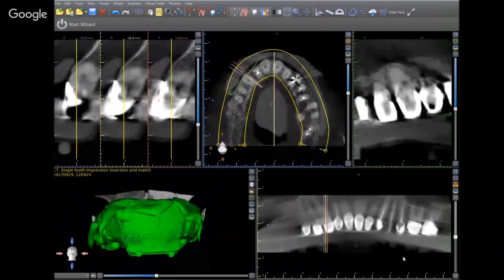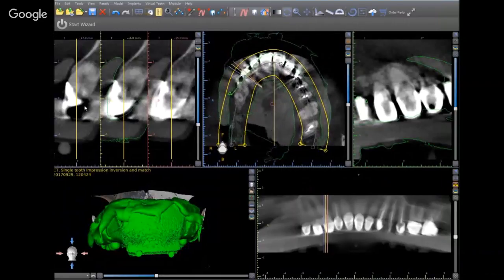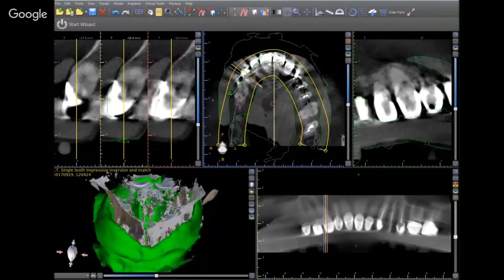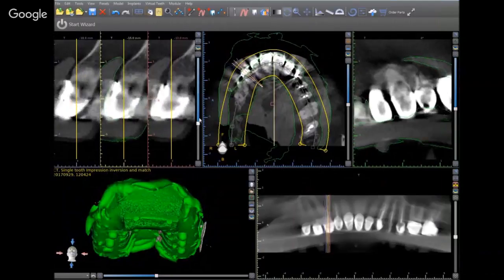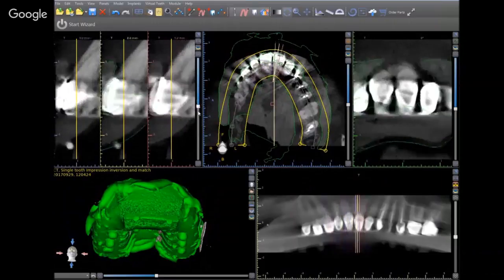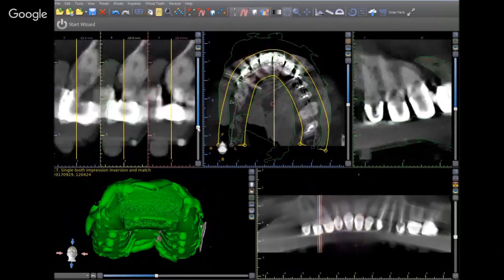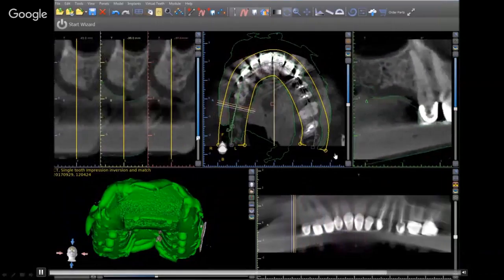That brings it back into your main windows here, and you can see now if you turn on the hint, you can actually see how the 2 images are aligned. What you're looking for here is the lines in the hint to line up with your impression, because the impression will show up in this image. And you can see if you look down here, you can see the glass beads as well as we go through the slices and how the glass beads are matched up properly as well.